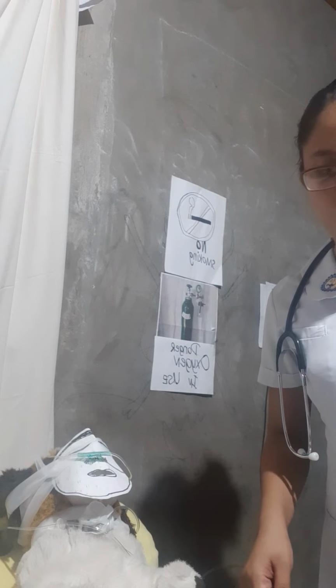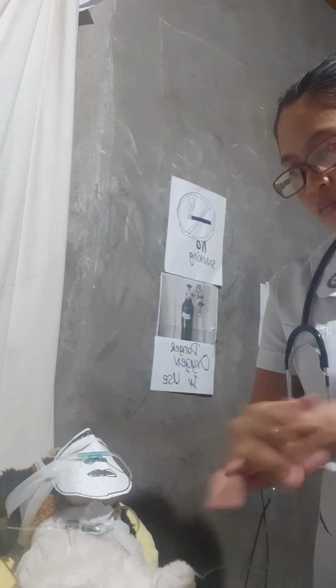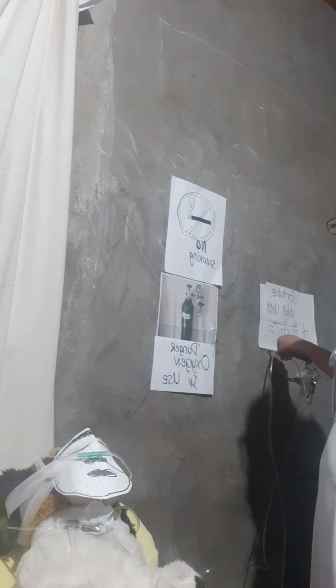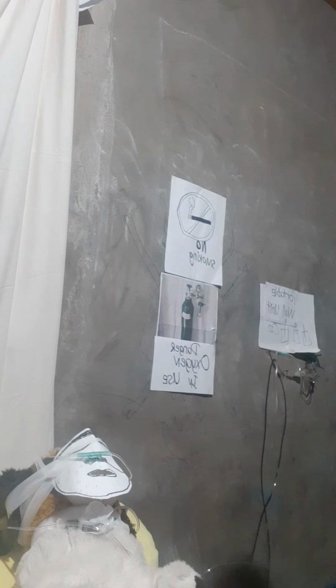Then perform hand hygiene. Next, turn off the suction device and place the oxygen at normal level.